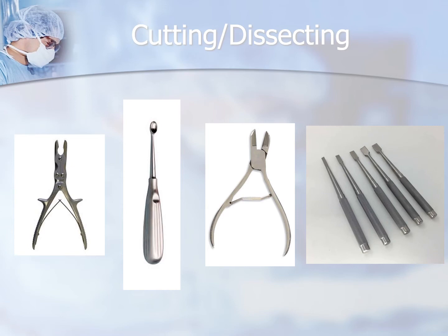So what's going to happen is as we squeeze, I'm going to try to draw a couple arrows here. As we squeeze these handles towards each other, we're going to get movement right here, and this part right here is going to move out that way. That creates a space right there.